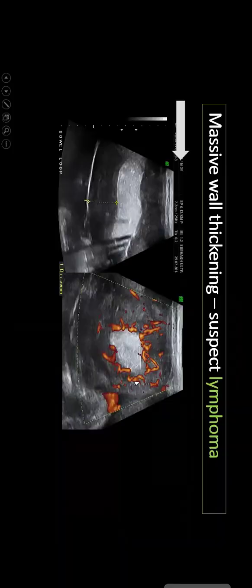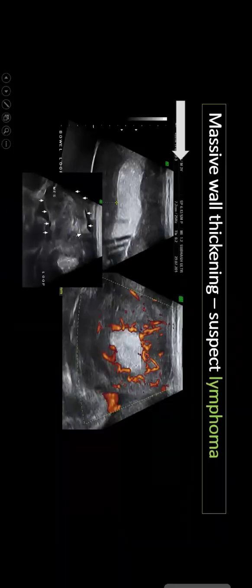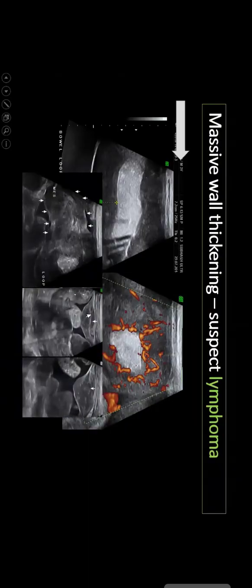Significant thickening, hyperemia, lumen is preserved, dilated. See the thickening, the mesentery is also thick. The tumor is extending within the mesentery. Multiple extra intestinal nodules are present in the parietal peritoneum, along with the mesenteric nodules. These are the typical findings of lymphoma.